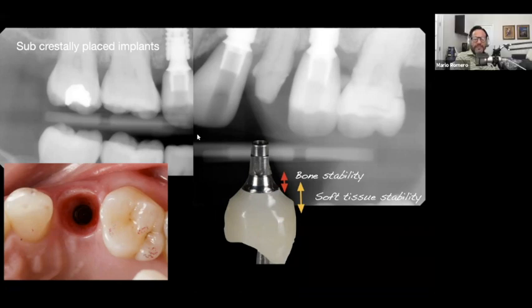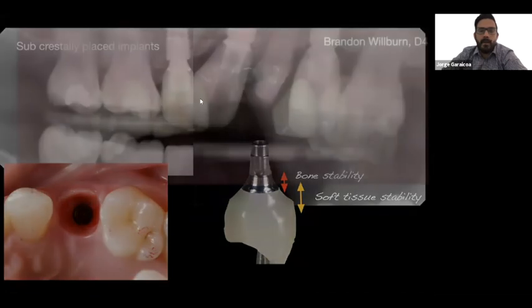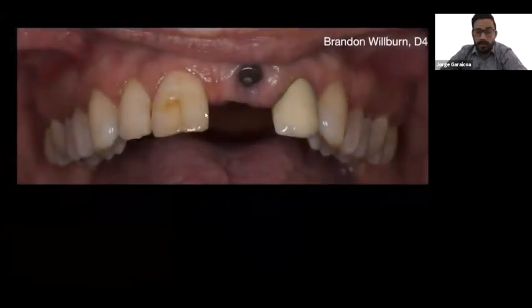So they both can have a high impact on bone. It's very important that you consider that if your implant is 2 millimeters under the crest, then you should use a 2 millimeter tissue cuff height abutment. If you use one, most probably it's going to be super tight, and the tissues around it are going to collapse. They're going to be strangled by this abutment.